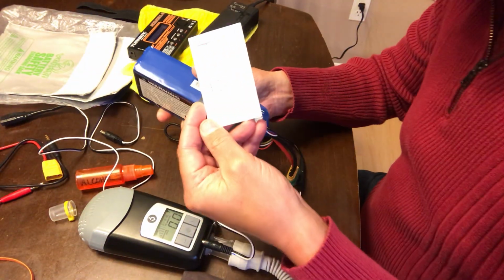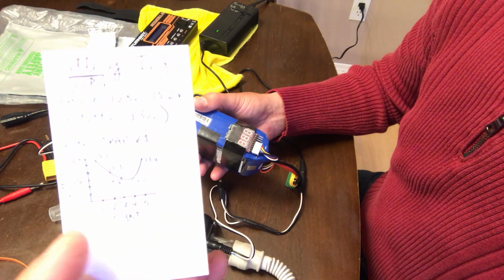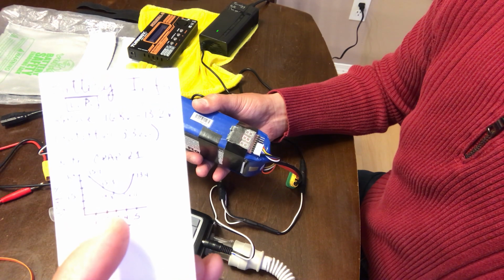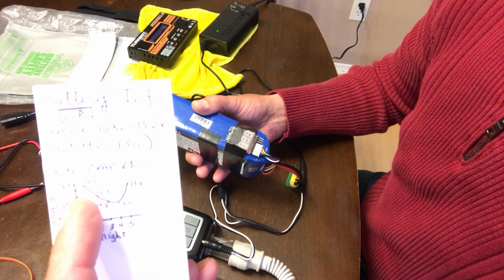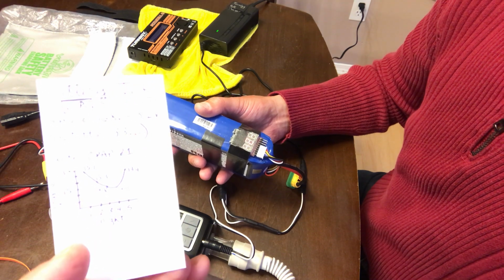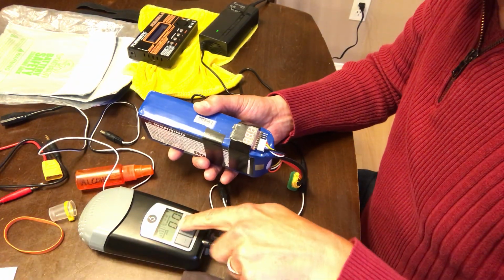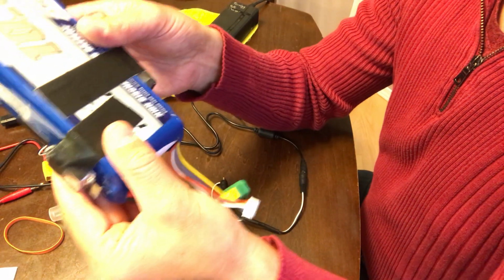This isn't gonna light up, is it? Here. So as the battery starts to drain down, you can see my little bar graph here. Each night I would map it just to test it, and it would go 15.9, 15.3, 14.8, 14.4, and then 13.4 by night 5. The drain would happen pretty quickly, then slow down, and then speed up at the end for some reason. Didn't quite understand that, but that's with the Z1 CPAP machine, and that's what I got when it was set at 9 centimeters of water. So that's another device I taped onto here, and I had both of these on here.